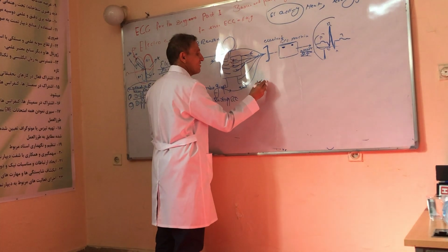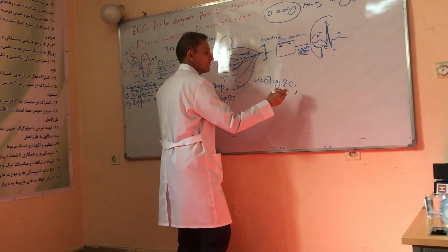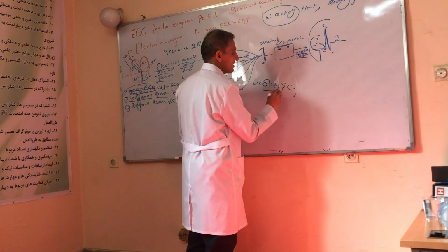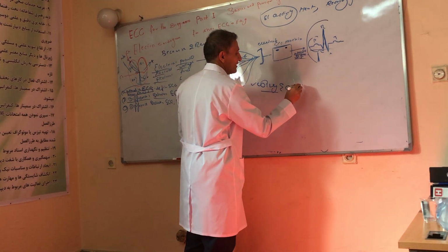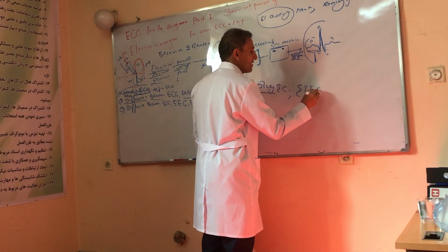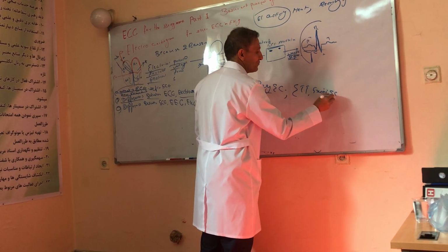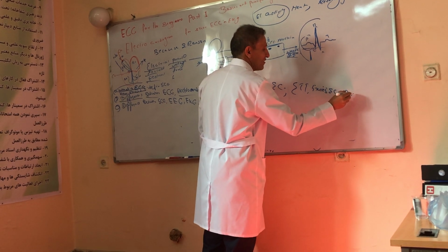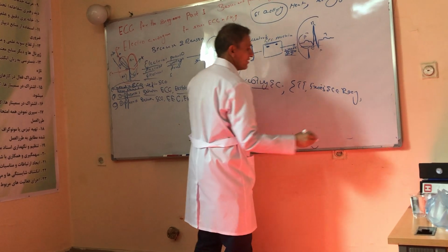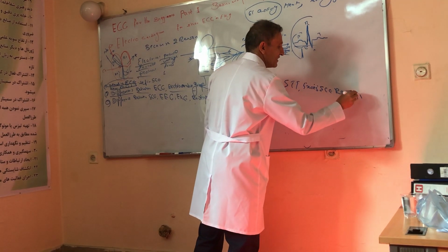Resting ECG. After resting ECG, we have ETT or exercise ECG recording. ETT, exercise ECG recording, or TMT.